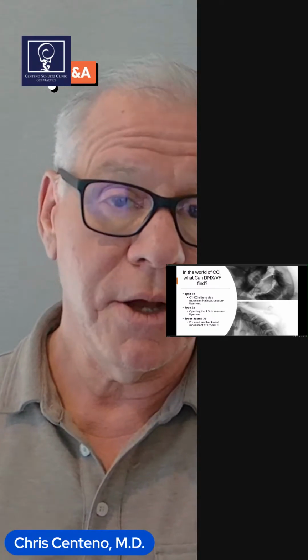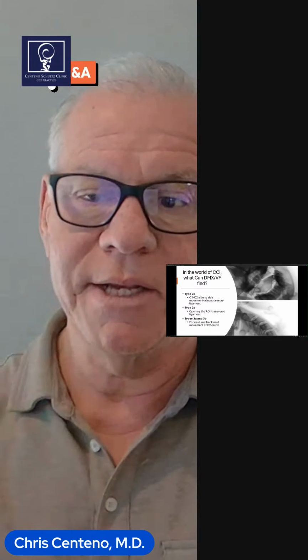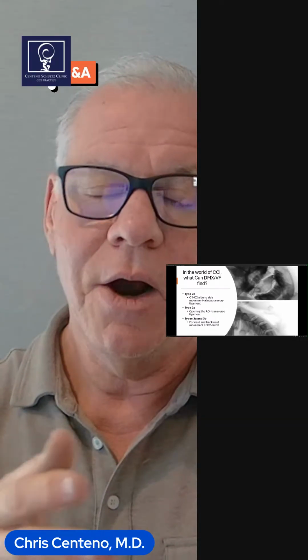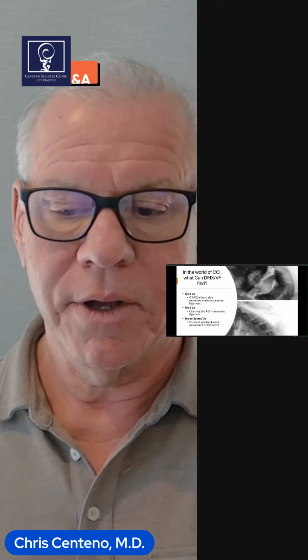It can look for a type 2A. I think it's the most sensitive way to find a type 2A. That's where the transverse ligament is failing and you have too much opening between the atlas and the dens, or what we call the ADI, atlas dens interval, or atlantodental interval, you could also say.